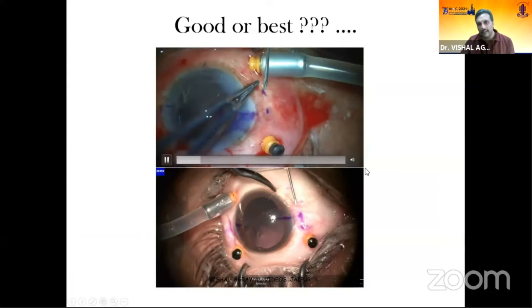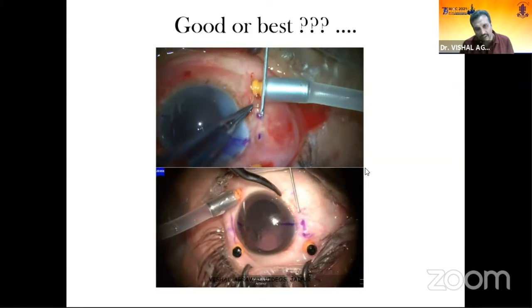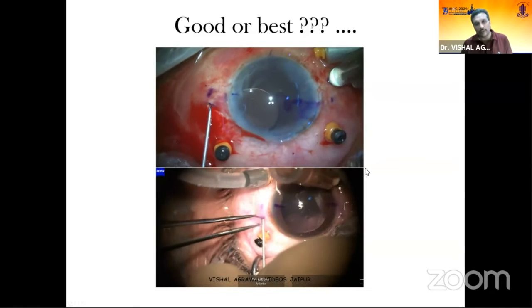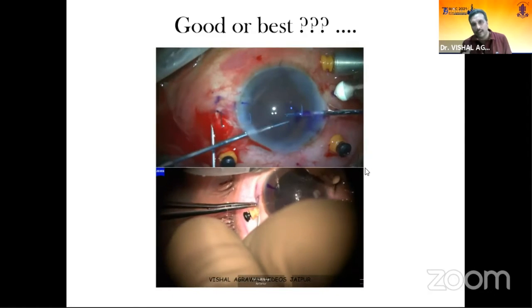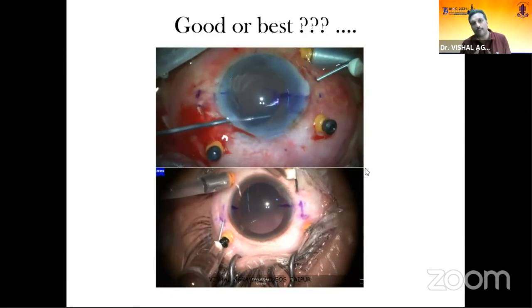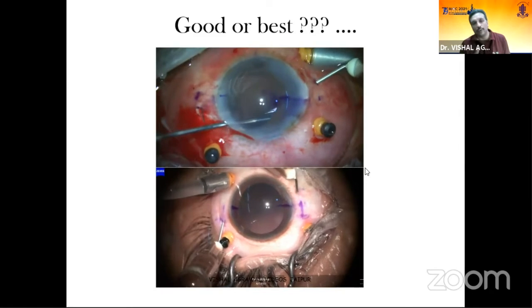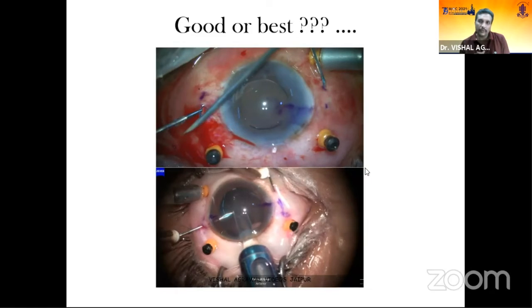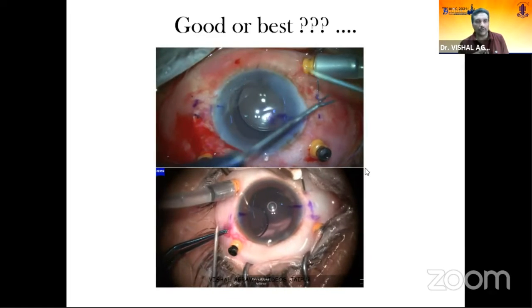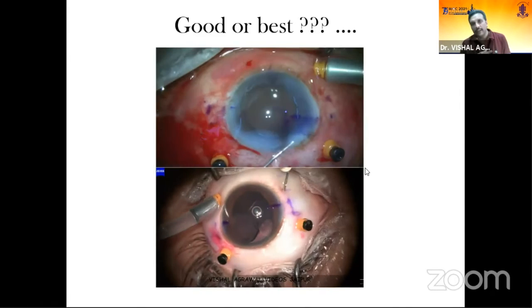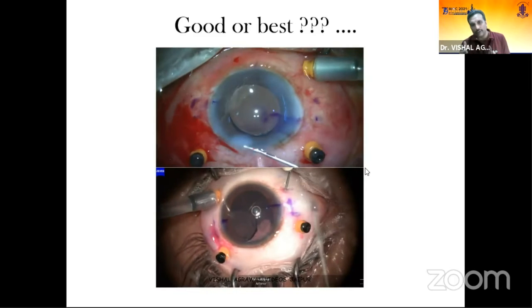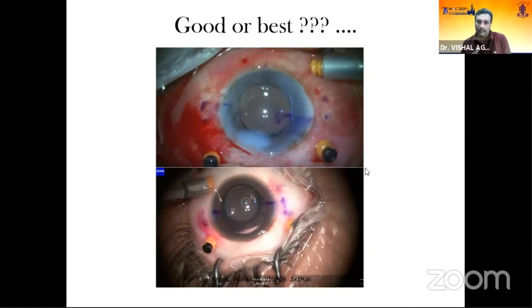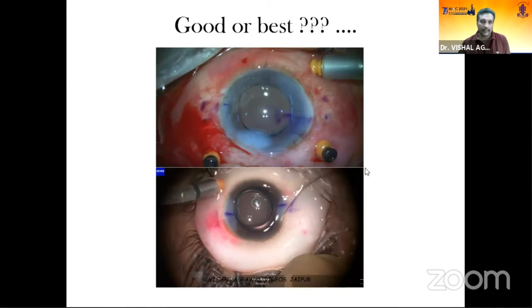Both these clips are of a Yamane technique I'm performing and both are good in quality, but the lower clip has a Zeiss overlay. Never put a company logo overlay over a recording, because the quality of the video deteriorates a little bit with an overlay. On cursory inspection both look good, but the clip without the overlay is the better one.